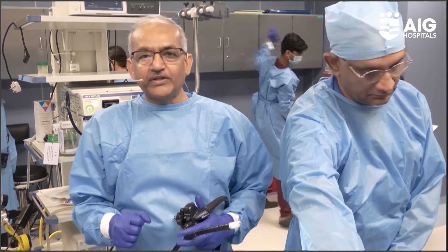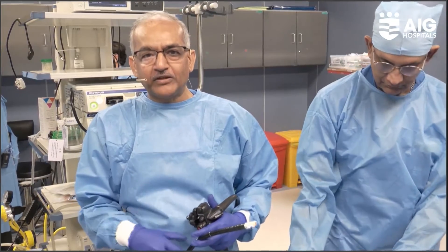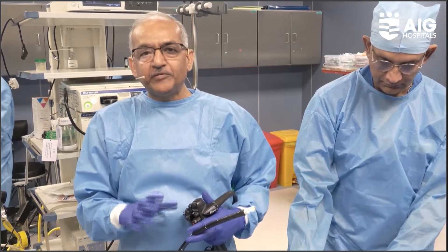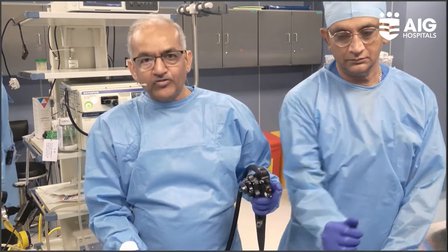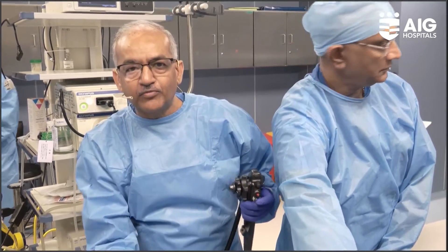A 60-year-old man with a history of significant abdominal pain for the last month or so. He has lost more than 15 kg during this period. Imaging shows a pancreatic body mass. The aim is to perform an endoscopic ultrasound to evaluate this pancreatic mass from close quarters.